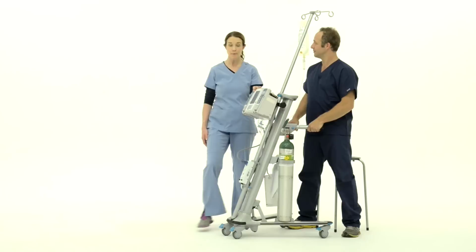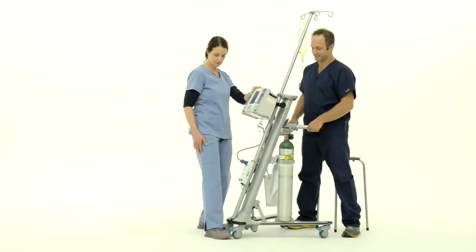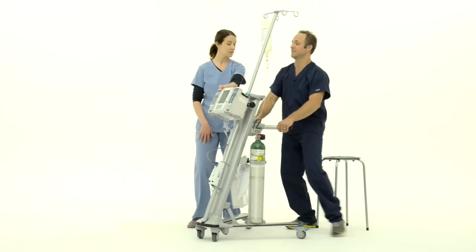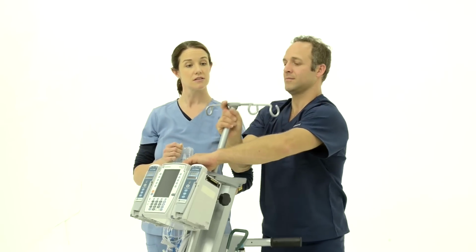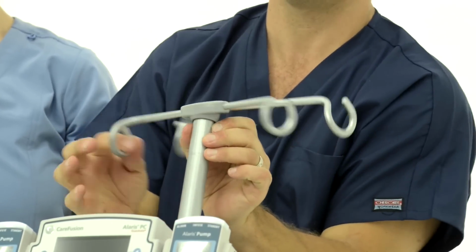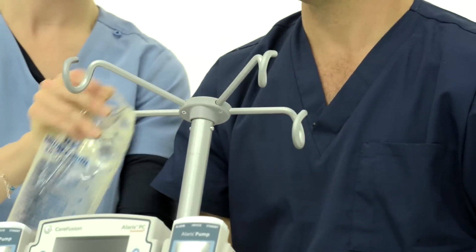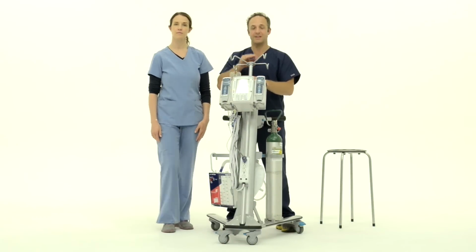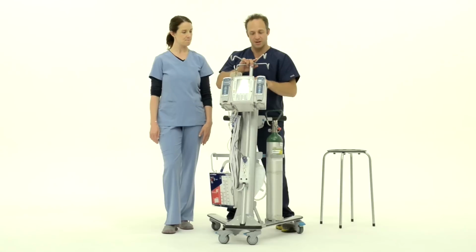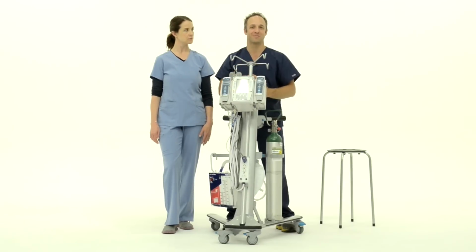When your patient is up, you want to release the brakes, and this is a great time to lower the IV hooks if they've been raised, and spin the hooks away from the patient's face. And just make sure that you've positioned the hooks at least 3 inches below the patient's chin so they have a clear field of vision.